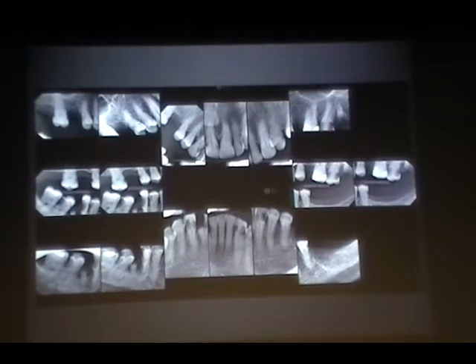It's missing one of the lateral. Louder, please. It's missing one of the lateral incisors, so the sensor should be placed on the incisor of the two central incisors. I was hardly able to hear. Did you guys hear? Okay, then fine. Move on. Thanks. The image is too angulated, it's not parallel to the occlusal plane. Yes. And next one. Megna.